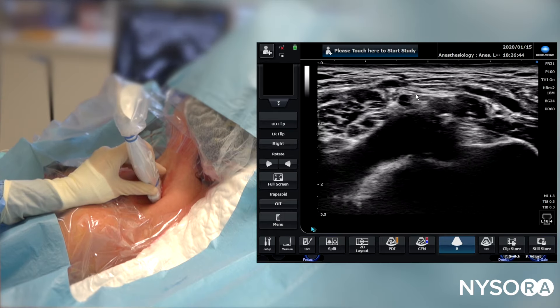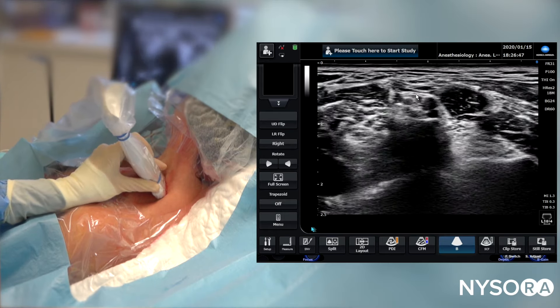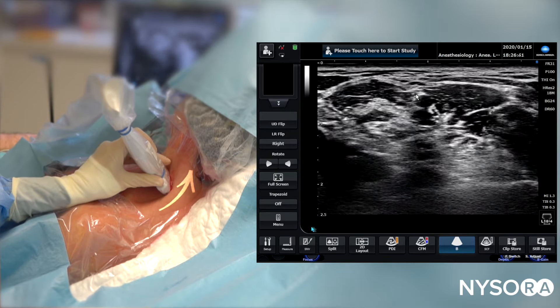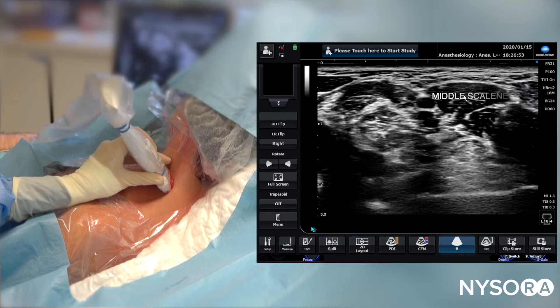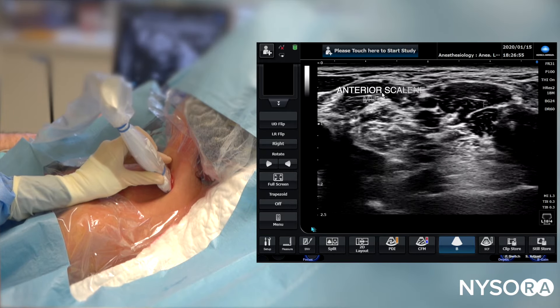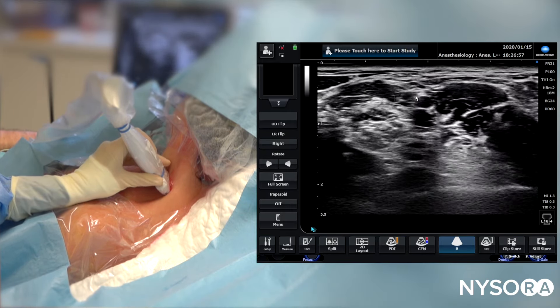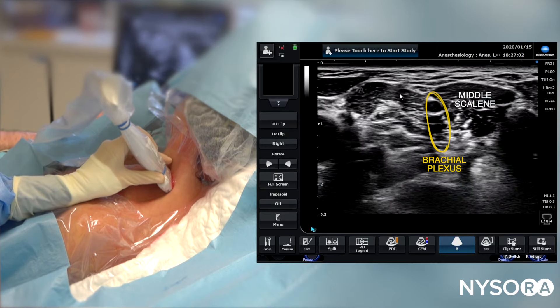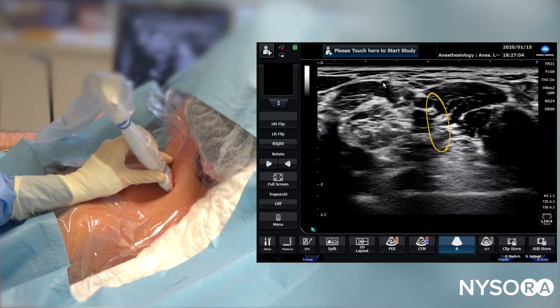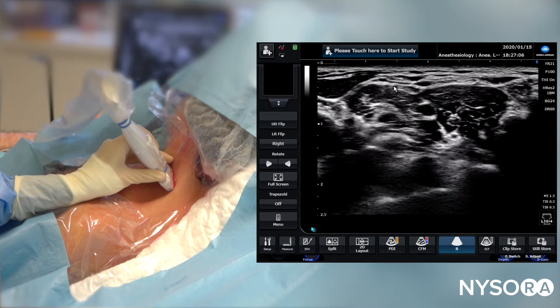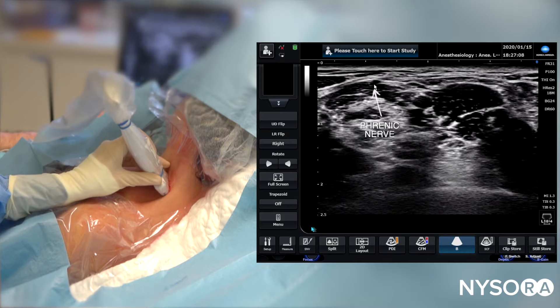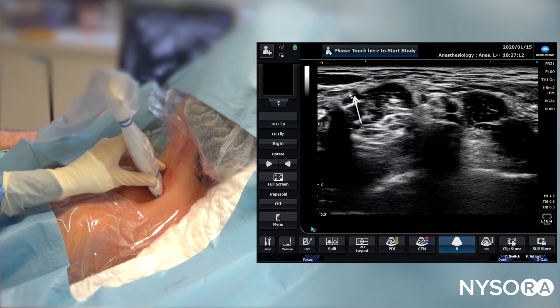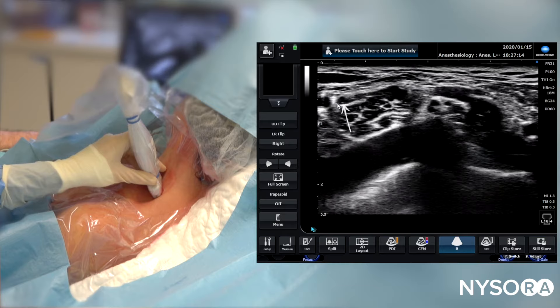We can decrease the depth a bit more to get a bit more granularity. Now we're going to advance the probe proximally. As we advance the probe proximally, we see the middle scalene muscle, anterior scalene muscle, and the elements of the brachial plexus sandwiched between the middle and anterior scalene muscles. Here is likely the phrenic nerve, which moves underneath the fascia of the anterior scalene muscle.